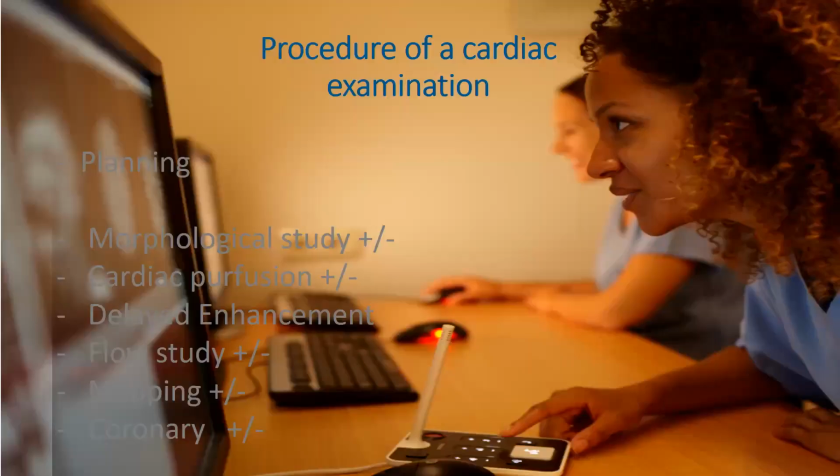Here I want to try in this session to explain several parts with different stages of cardiac MR. Of course, I will explain the CINE study, morphology, and the delayed enhancement study. Also, how to do cardiac perfusion, the sequence and the post-processing for the delayed enhancement.